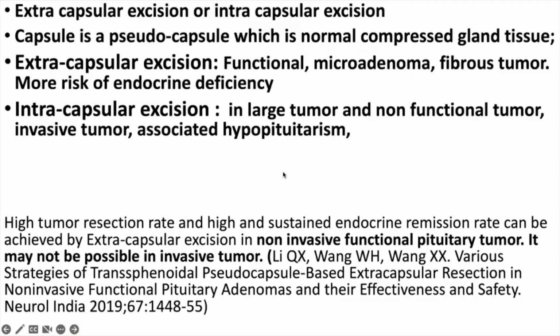There are two types of excision of the tumor, extracapsular excision and intracapsular excision. Basically, the capsule is a pseudocapsule. It is not a true capsule. So it's a normal compressed gland.